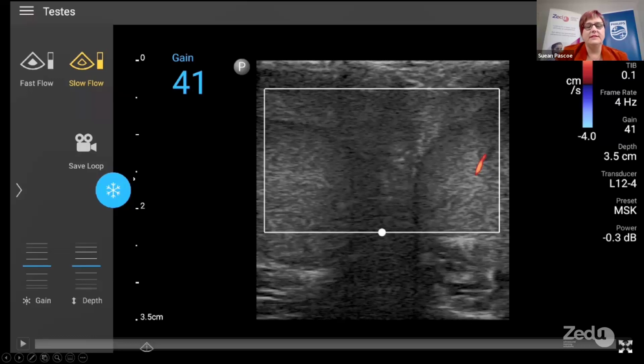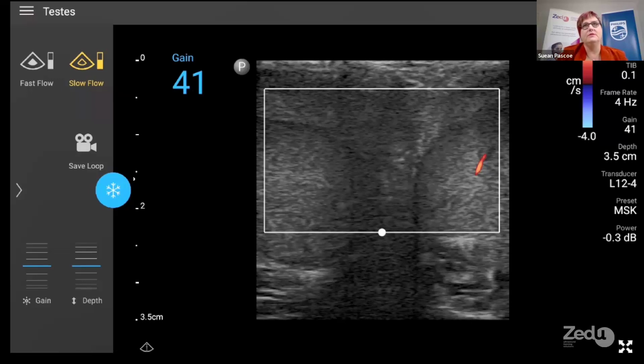If you've got no flow, then sometimes it's hard on the point of care systems. I've used a couple for some of the pictures here, and the color sensitivity on some of the point of care systems in that small parts thing, it's not their strongest point. The machines are designed to do lovely echo or lovely abdomen imaging, but the color sensitivity on some of the linear probes of point of care systems can be a little bit tricky to get good pictures out of. So beware on young kids getting color flow, the vessels are even smaller. So that's going to be really difficult as well.